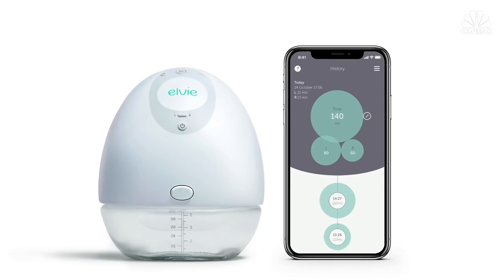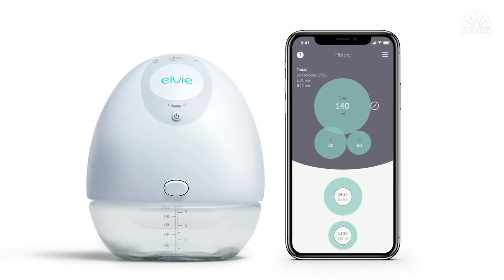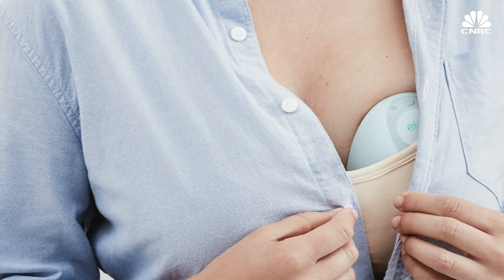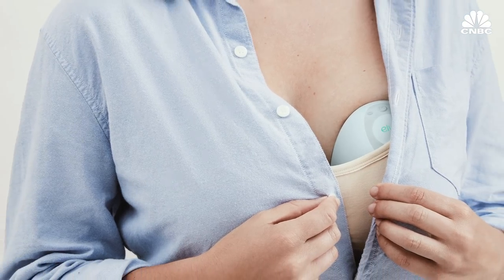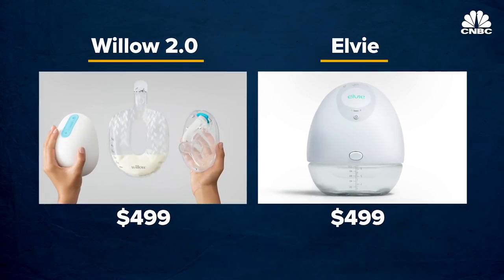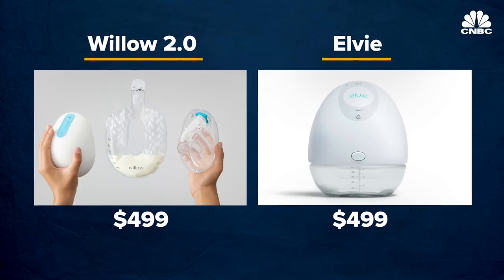Willow now also has direct competition from a British company called Elvie. They won a Best of Babytech award at CES this year, and it's another wearable, tube-free breast pump. Both the Willow 2.0 and Elvie pump will be shipping early this year, and both are priced at $499.